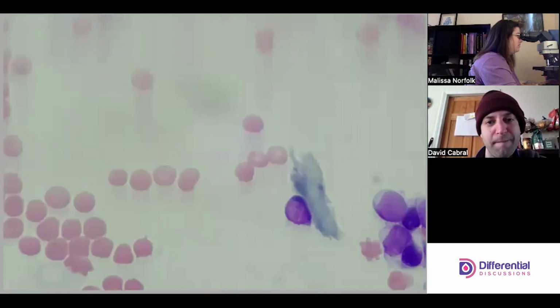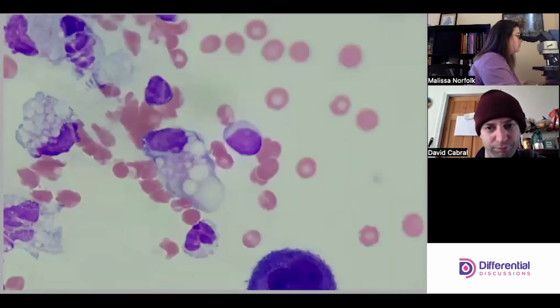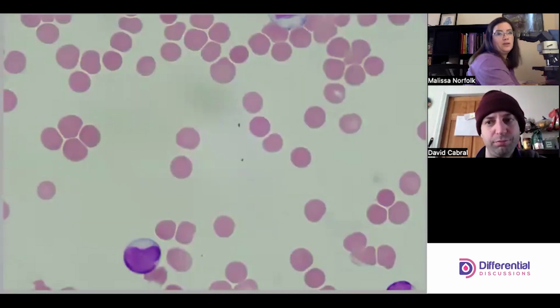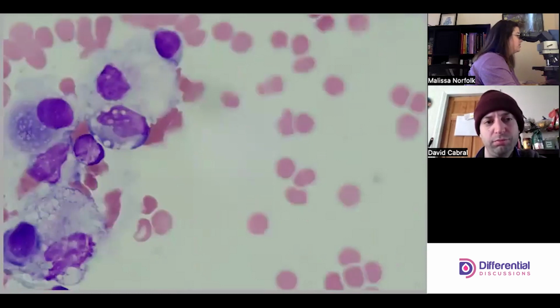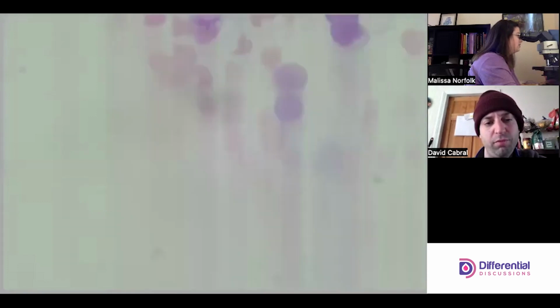Again, I think we've seen malignancy before when looking at some of these slides, but malignancy is going to look different with each patient, and it's important to see the different ways that malignancy can present itself. Yeah, agreed.